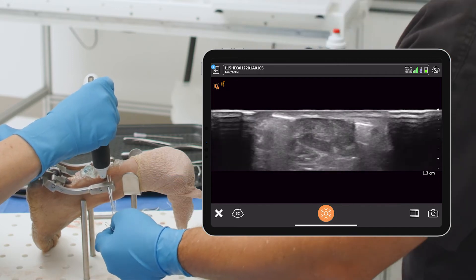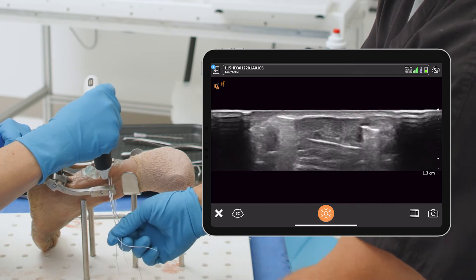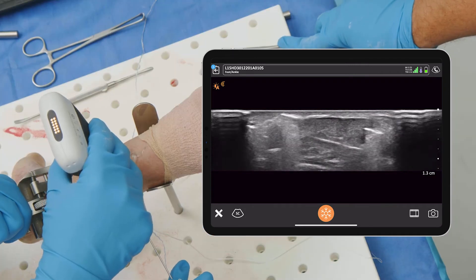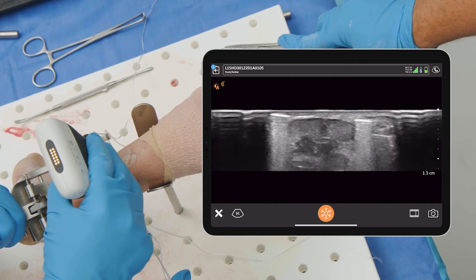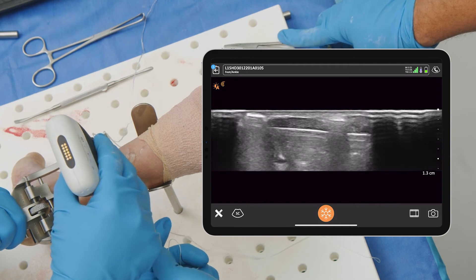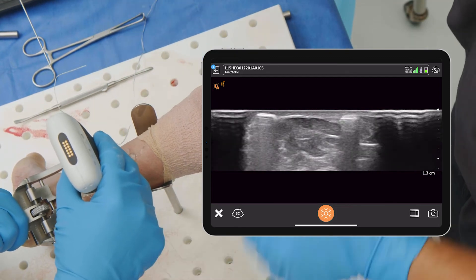Once again I'm going to make it bad intentionally — push through and stop right there. You can see we're way deep to where we want to be, so that would not be appropriate. Pull it back a little bit, then I'm going to reorient the jig. Go ahead and push through — boom. That's beautiful, maybe a little superficial but totally good. You could make an argument you want to be a little deeper, but I think it's actually good for our purposes today.